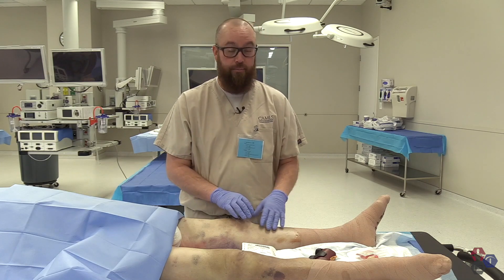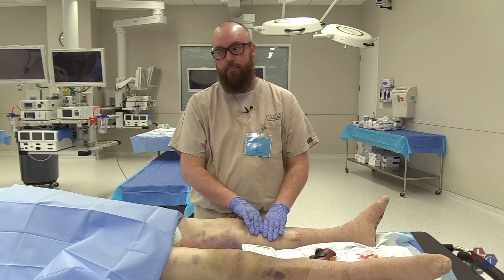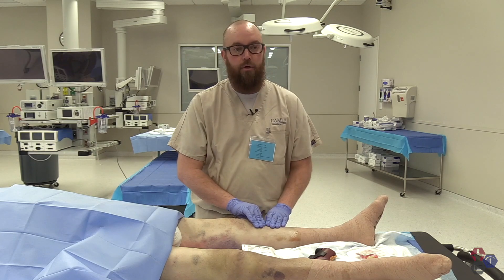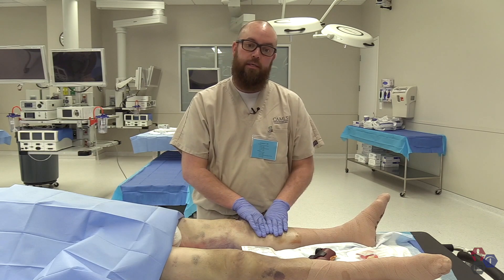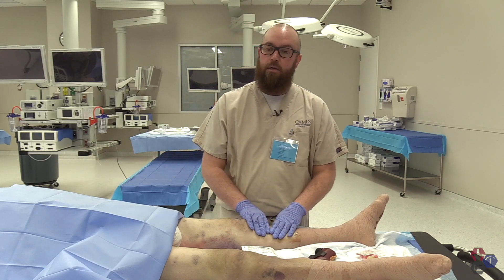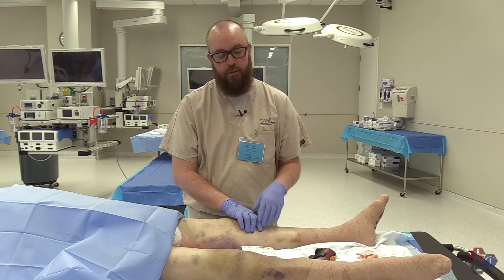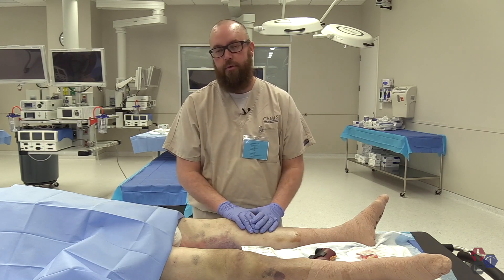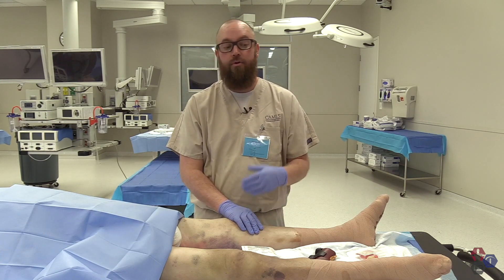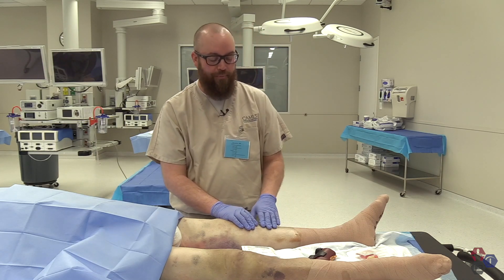Complications such as compartment syndrome. Your biggest complication from tibial plateau IO is compartment syndrome. You don't see that in the other anatomic places where you can place an IO.